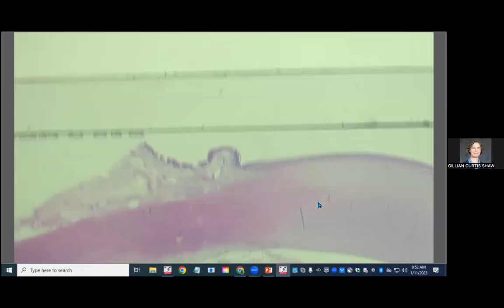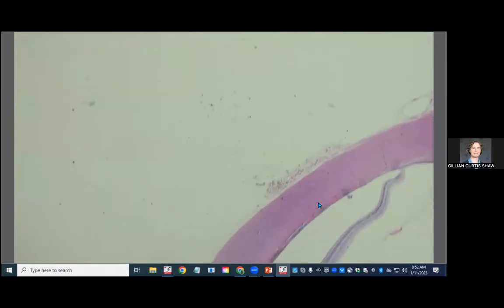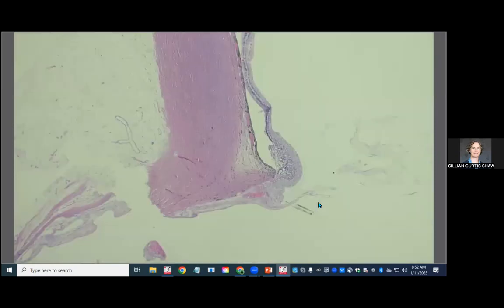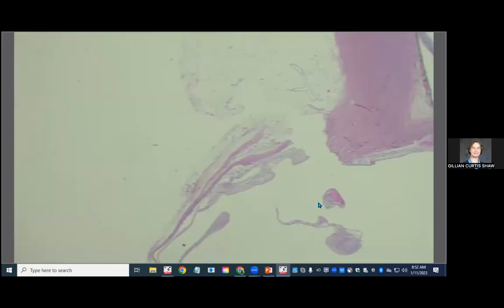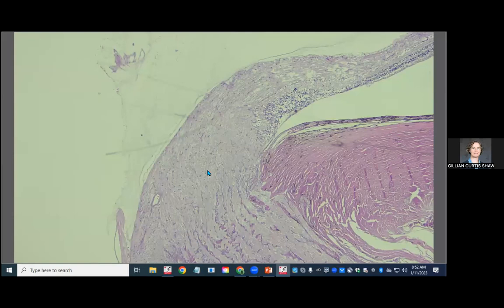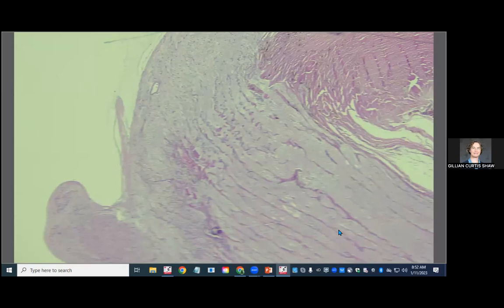So the front of the eye is pretty boring. I did actually appreciate conjunctivalization of the ocular surface that they reported earlier. The retina that's inside the globe looks pretty normal, actually, although I think there are decreased numbers of ganglion cells. And then as we follow that into the outpouching, let's go to the other side, actually. So here's something that actually looks pretty identifiable as optic nerve head. Let's go one higher, leading into, so here's the lamina cribrosa leading into the optic nerve itself.